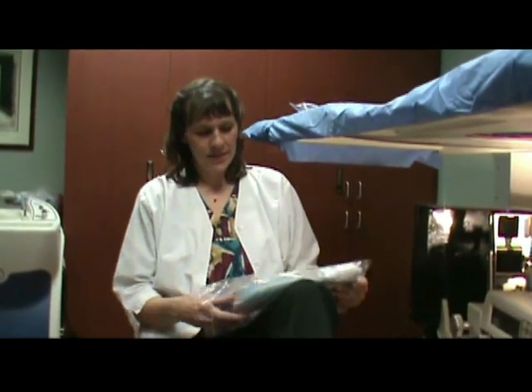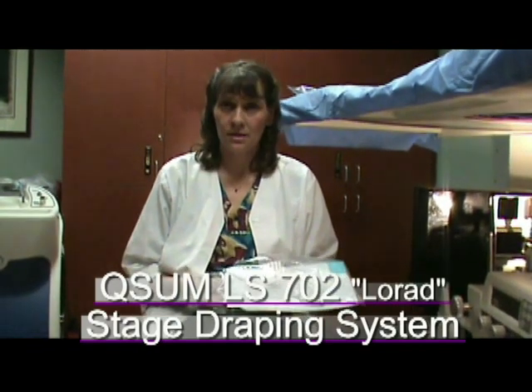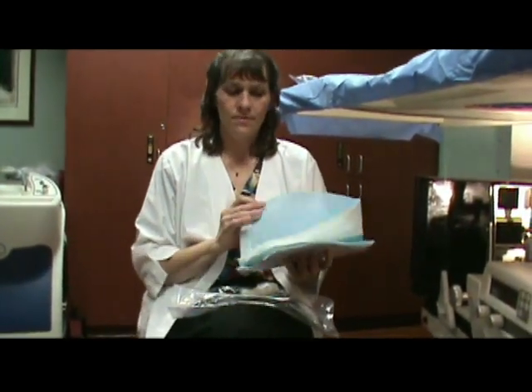This video will show the proper installation and advantages of the QSUM LS702 LORAD stage draping system. The stage draping consists of two pieces — we call this our one-piece draping system.